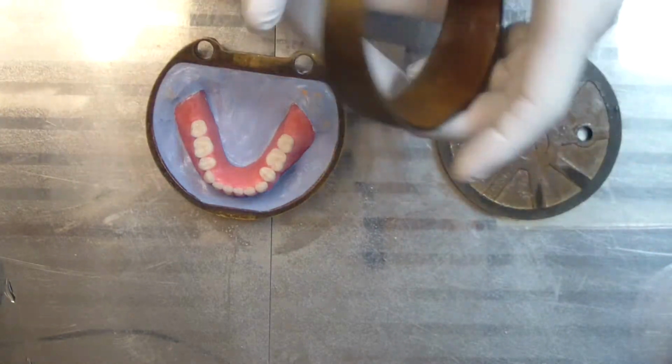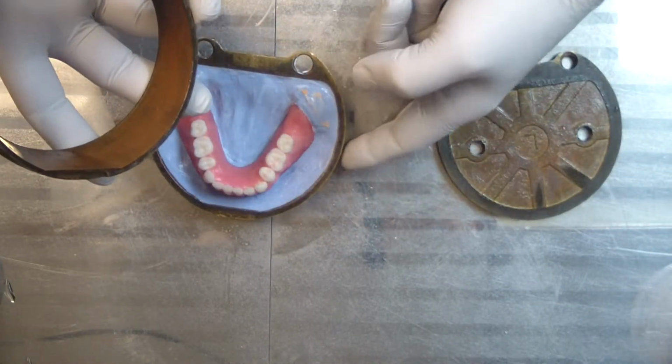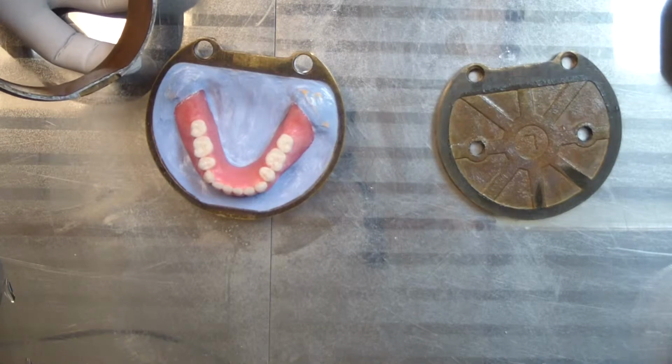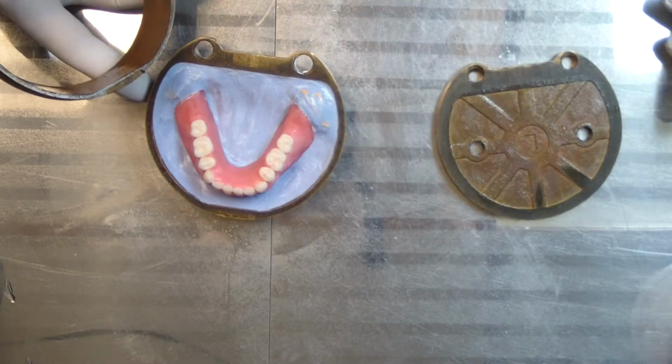Then you obviously thoroughly lubricate your flask. I did it on the bottom when I did my first pour, and I also lubricated the cast so you can remount it. This kind of flasking is a little bit different than what I usually do.